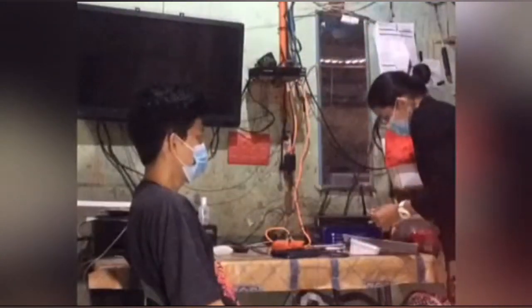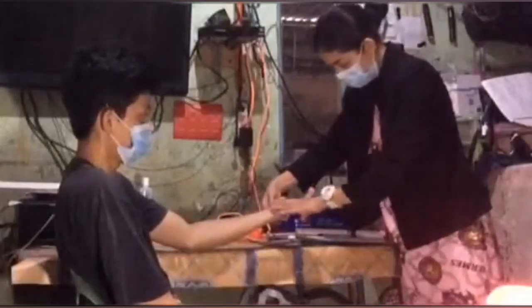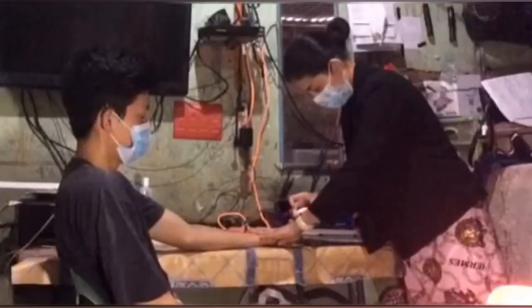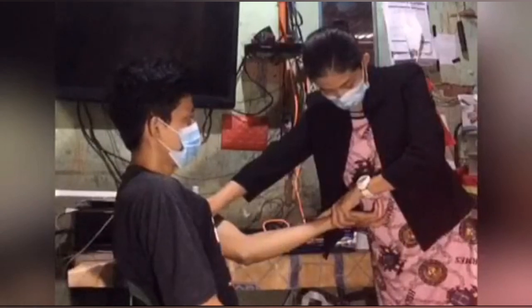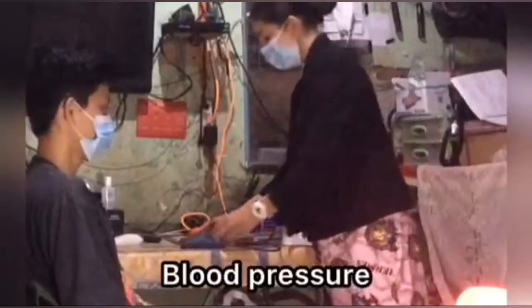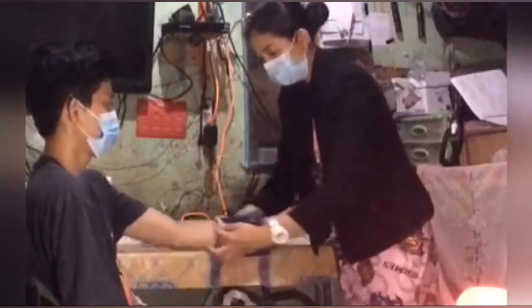Okay, just right. Your temperature is 36.6 degrees Celsius. Next is the pulse rate. Next we will take your blood pressure, sir. Here, sir.